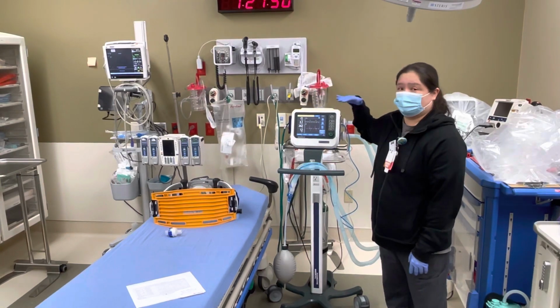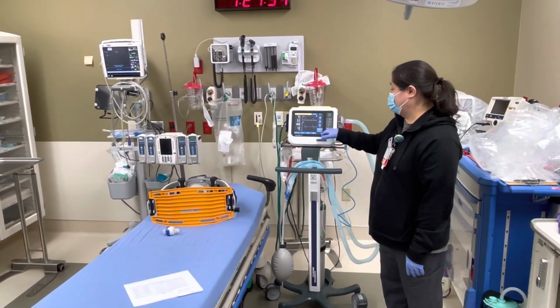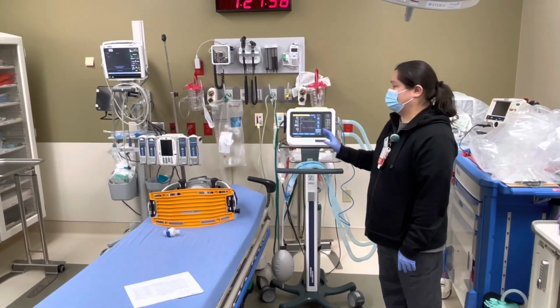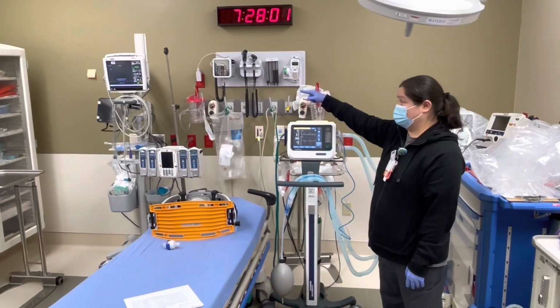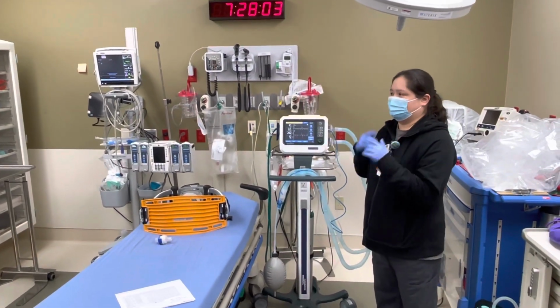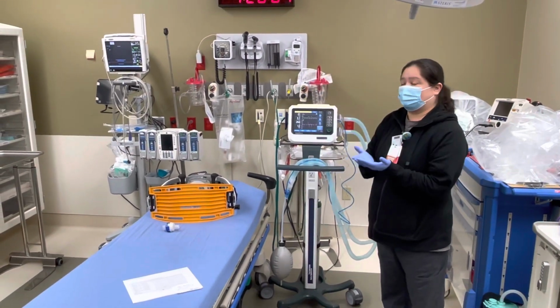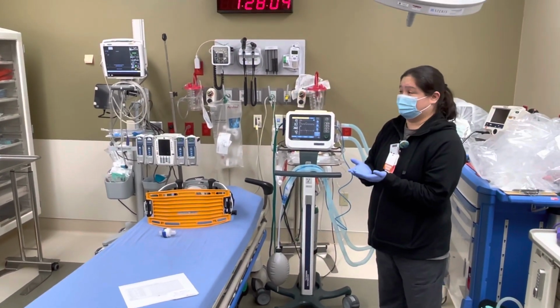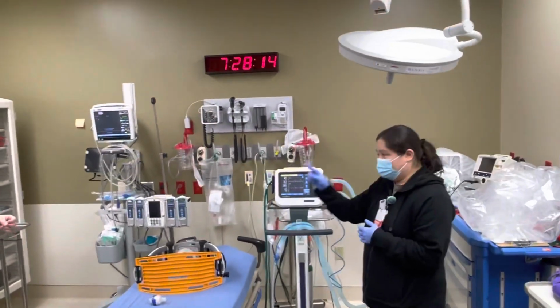If oxygenation is the issue, then you're going to see it in your SAT. So if your SAT says it's 80, and you're on a PEEP of 5 and 100%, then that tells me you need to go to the doctor and say, hey, I think I need to increase this PEEP because my SAT is still saying 80. We usually try to correlate it to a gas just to be on the safe side because sometimes this is a little off. So PEEP is what I would increase? PEEP is what you would increase.